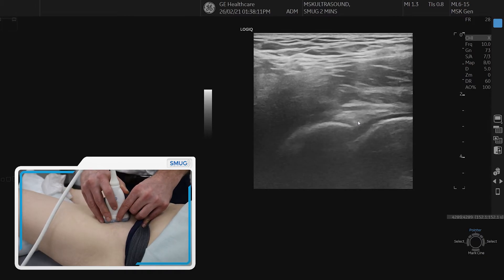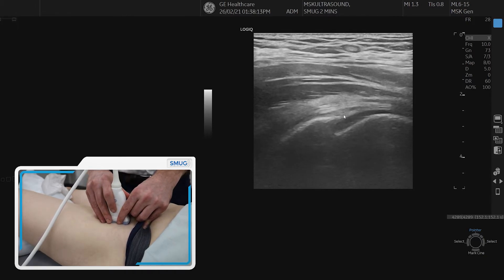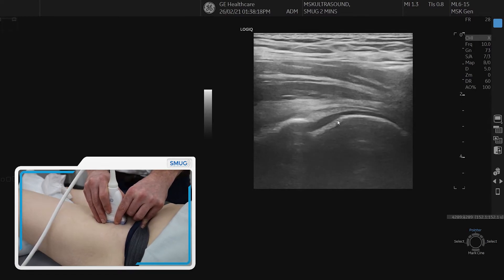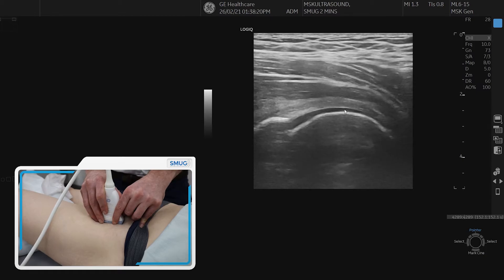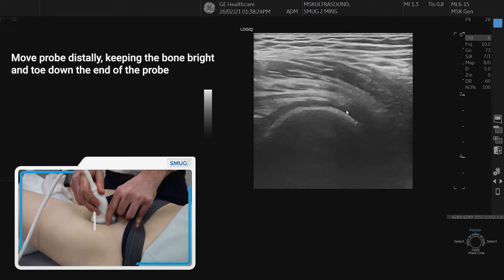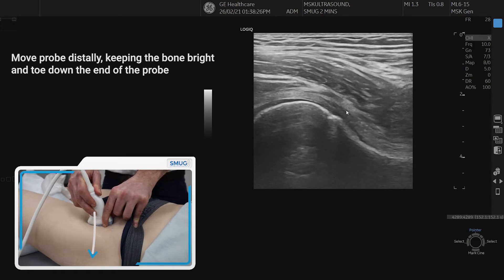If we go back into long section, we can also see the small hyperechoic region there, which is the labrum. Now, if we follow the articular cartilage, trying to keep the bone nice and bright, we can actually move distally until we see the femoral neck.